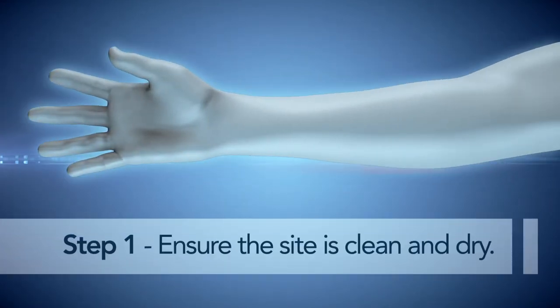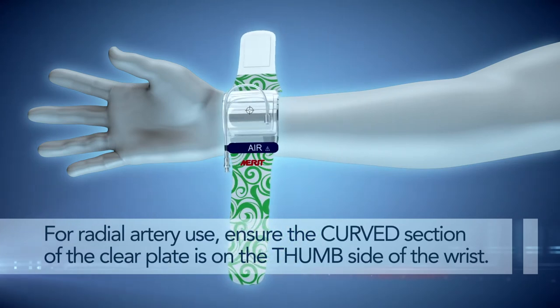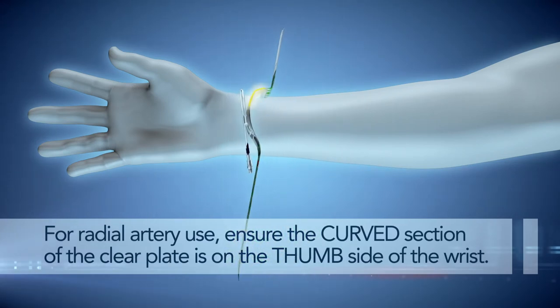Step 1. Ensure the site is clean and dry. For radial artery use, ensure the curved section of the clear plate is on the thumb side of the wrist.